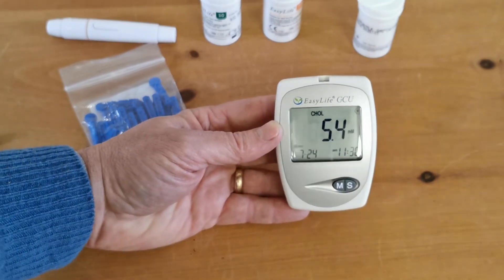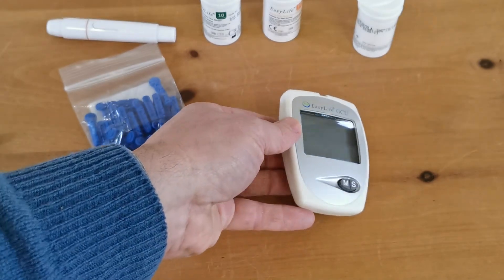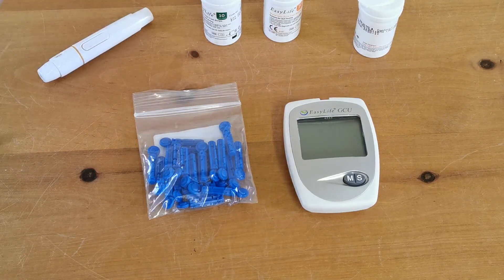So a very nice little onboard memory system built into this meter, which again is an additional plus feature if you're considering buying it in the first place. Okay, thank you.